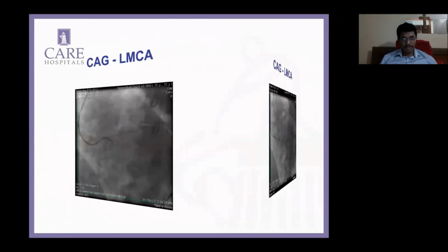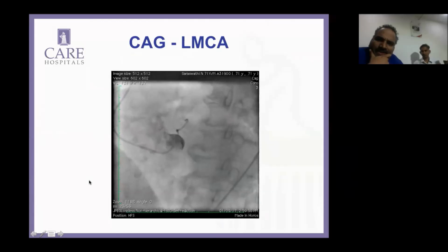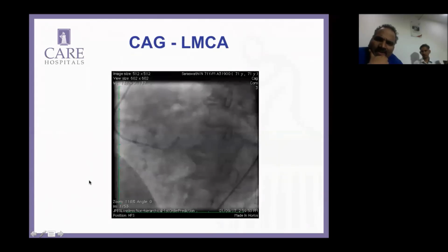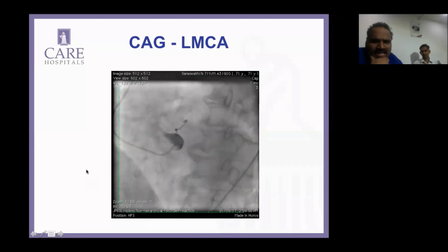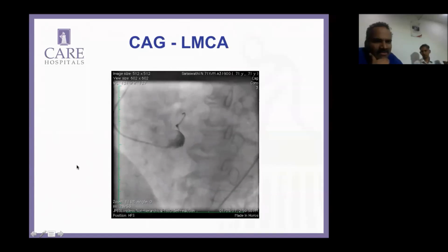So Sharad. Yes, sir. In your last injection, there is a small vessel which is visible. Only one vessel is visible. Yes, agreed. And this is a caudal view, am I right? Yes. It looks caudal, and it is going anteriorly away from the spine.